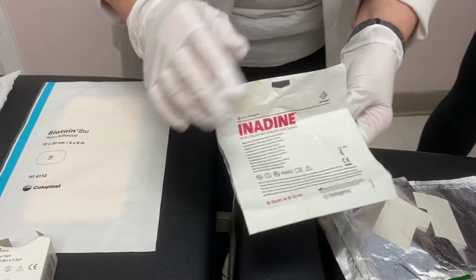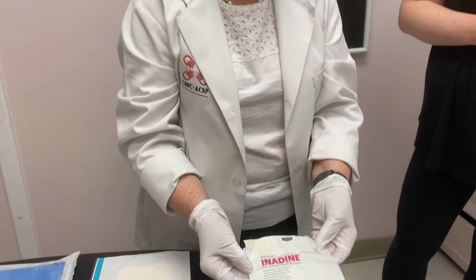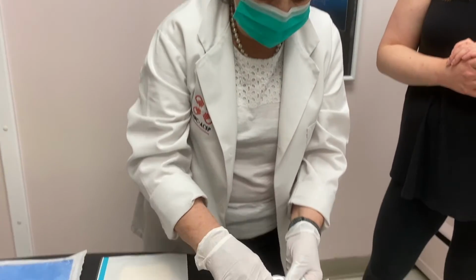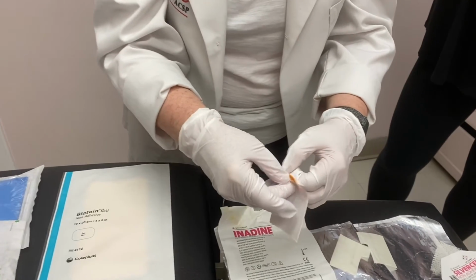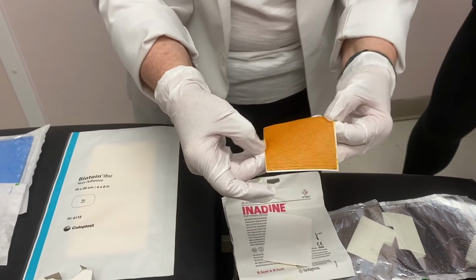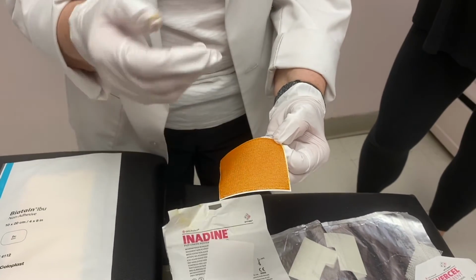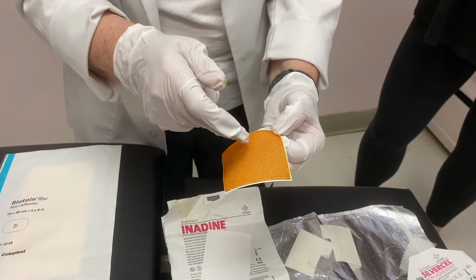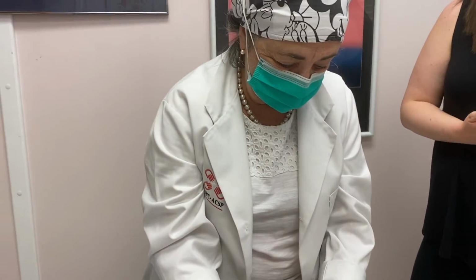This is a povidone iodine product. The most common thing that I think you would know is Betadine, povidone iodine. It's used a lot on cuts and bruises and what have you. And it is in a mesh. The beauty of this dressing is that it starts out orange, and when fluid comes out of the wound, it causes the iodine to be released from the dressing, and the dressing will turn white, so that you know that all of the dressing has been used.